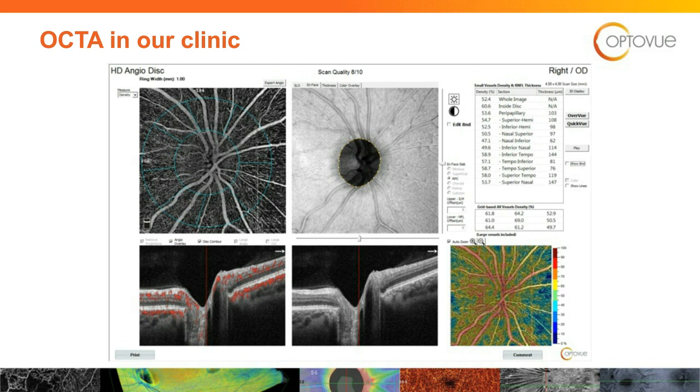If this was a retina scan, it would give you the whole macula. Again, it would divide the macula into these 9 quadrants. Look at the bottom right section down here, and you'll notice just above that a grid-based vessel density. You can see there's 9 grids, and you can see those 9 different readings. Here's the vessel density in the top left versus the upper middle versus the top right. And over time, you can see how these vessel densities are doing. Again, this is of the nerve. This would be a picture of the macula if this was an OCT angiogram of the retina. How do you get here?